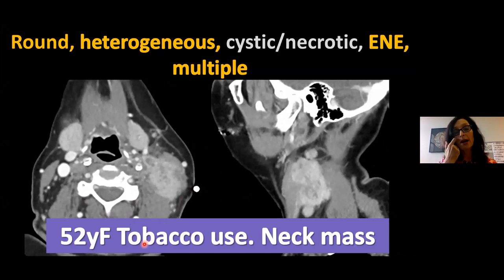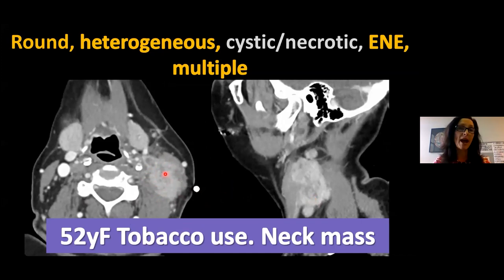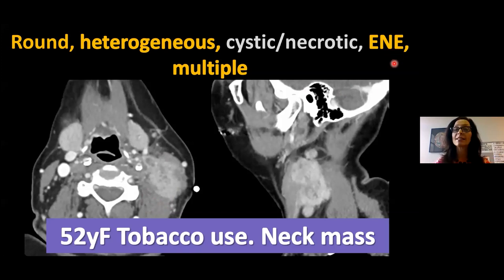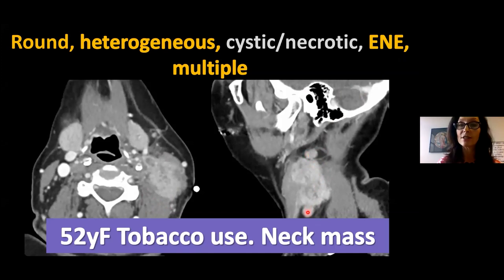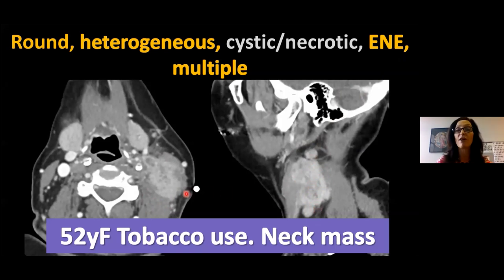Another case: a heavy tobacco user presenting with a left neck mass — a very heterogeneous, enhancing mass. Do I need to measure it? Clearly it's big, clearly it's bad. It's also infiltrating the sternocleidomastoid muscle and paraspinous muscles — no question this has extranodal extension. It's very rounded and heterogeneous. Once I've found that, I look above and below it: there are additional rounded, heterogeneous lymph nodes, which were also metastatic. Once you've found one abnormal node, you must look for more because it's important for staging.